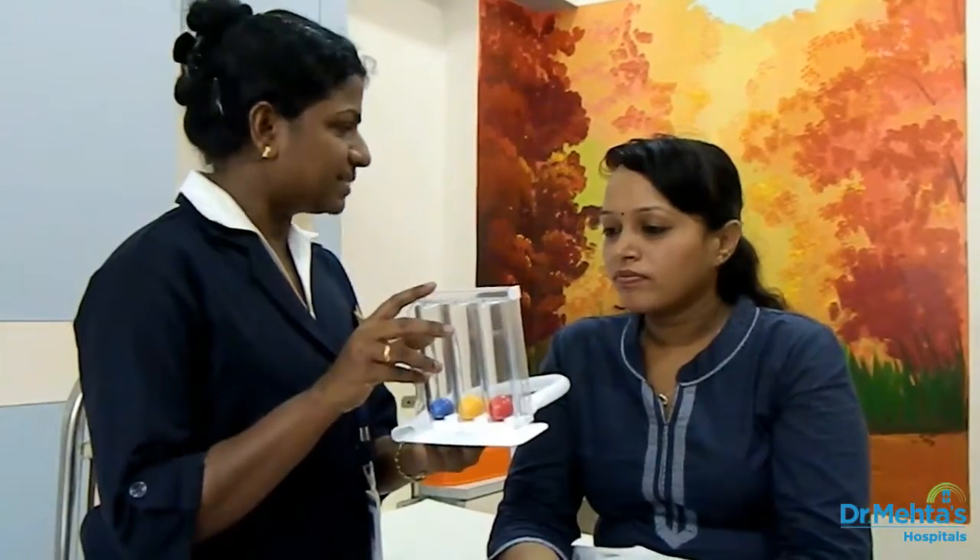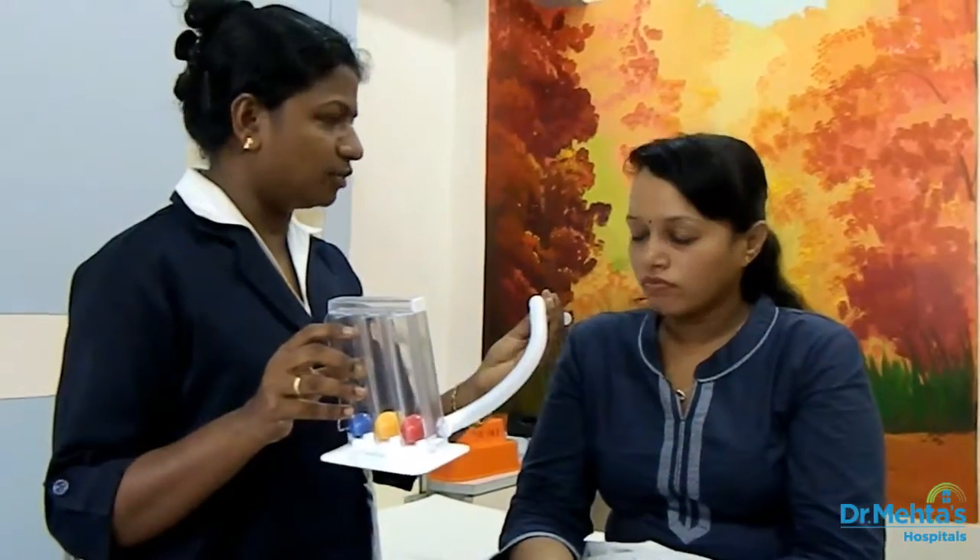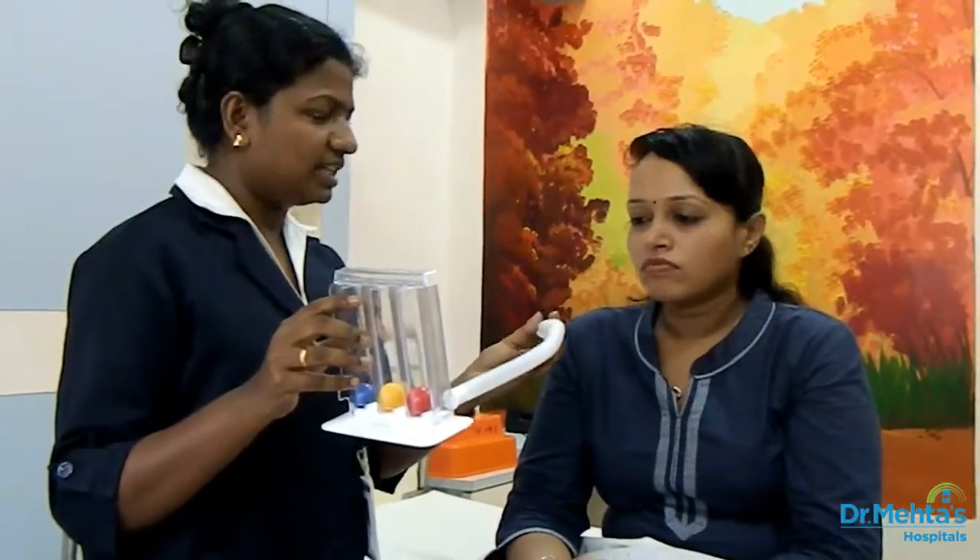Today I am going to demonstrate about this Spirometry exercise. This is the incentive spirometer. All you have to do is you have to keep your mouth over this mouthpiece and you have to suck in the air, so that the balls in the spirometer will go up and it stays.